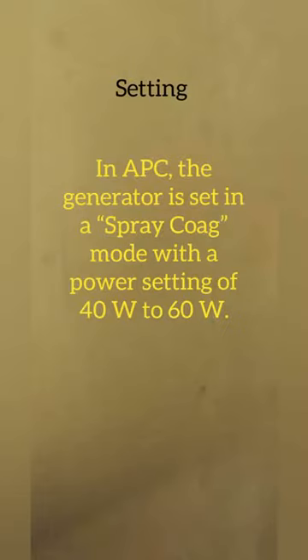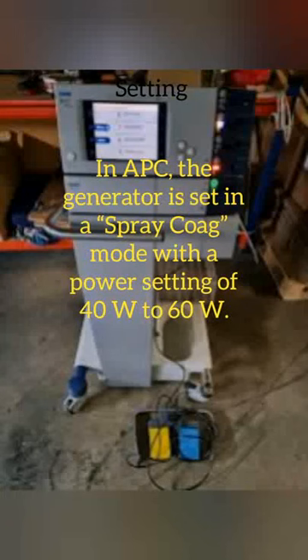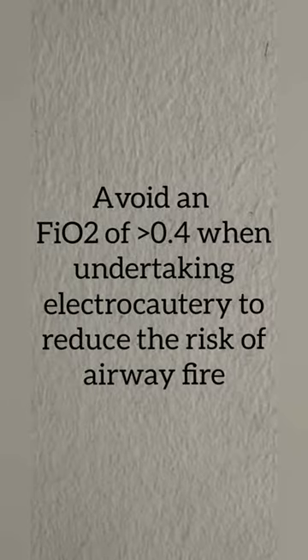About settings in the APC generator, you set the power between 40 to 60 watts. Remember to keep FiO2 below 40, especially during firing of the argon gas.